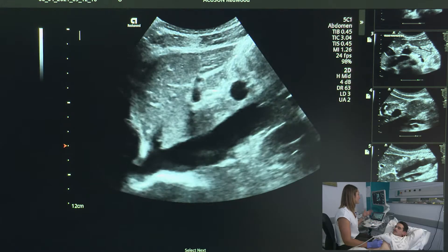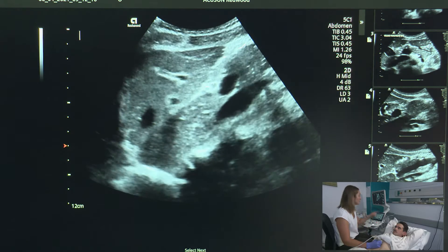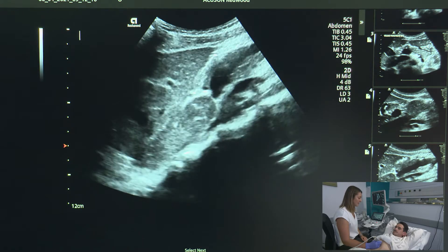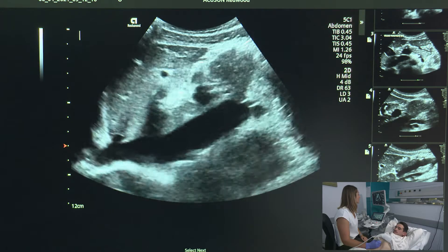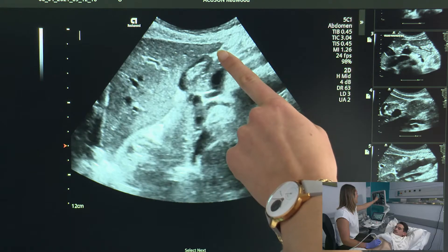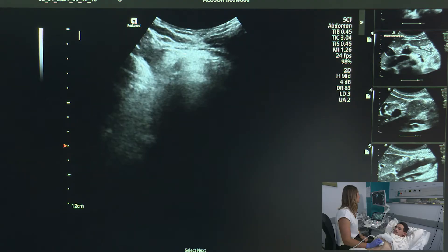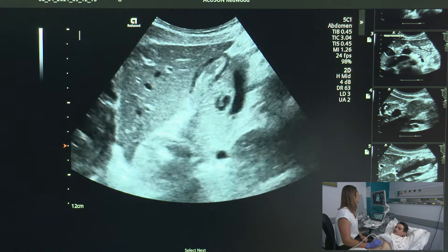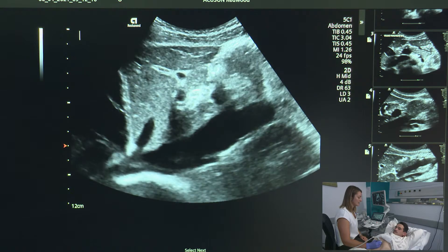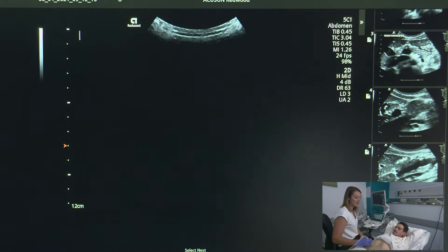Now I can be confident that I saw the superior portion of the left lobe of the liver. I'm going to move my probe inferiorly to match the inferior portion of the left lobe and do that exact same sweep. Big breath in. I'm not so worried if I cut off the diaphragm — I'm just making sure I have that tip on my screen the entire time. I sweep until I no longer have any liver tissue on my screen and come back all the way towards the IVC. Now I've done my sweeps, I know there's no pathology, and I'm happy to go ahead and take some images.